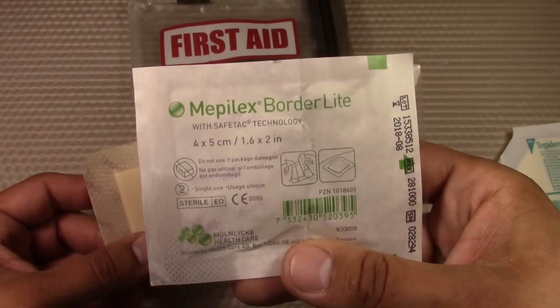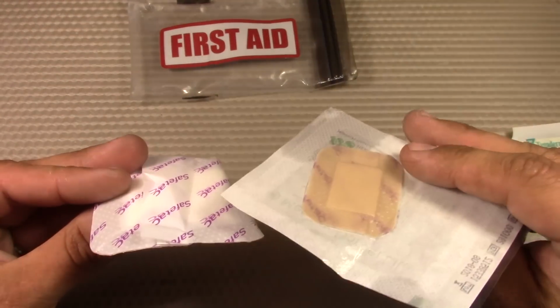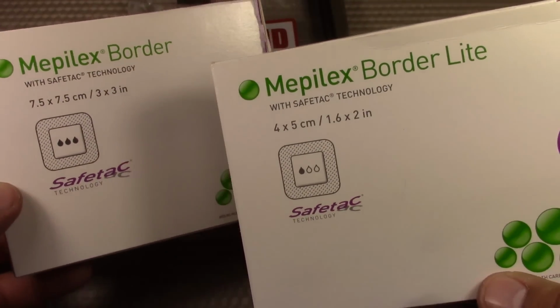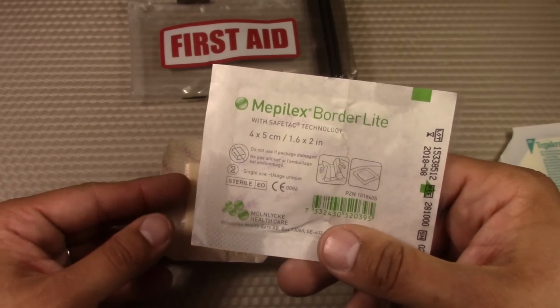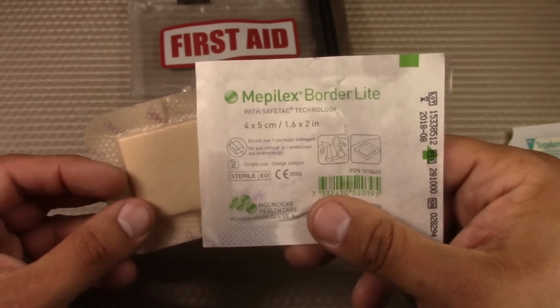And last, we have two of the Mepilex border dressings. So we have a light version, and then we have the normal border dressing. And these are just awesome modern wound dressings. They're shower-proof. It requires minimal dressing changes, for example, so you can have these on for several days before changing them. They're easy to replace when you do need to change them. Just a lot of great stuff about it. I've included all that information in the PDF document.